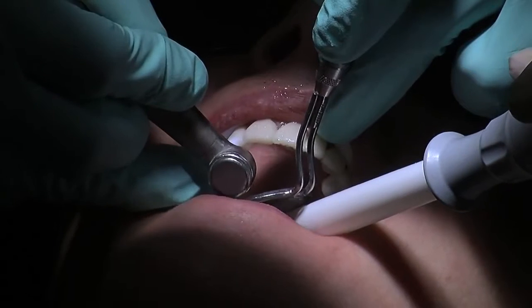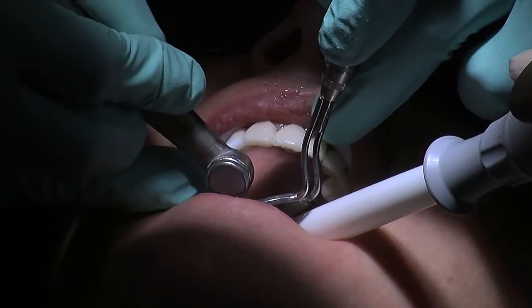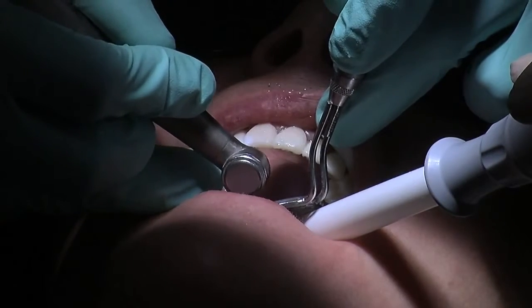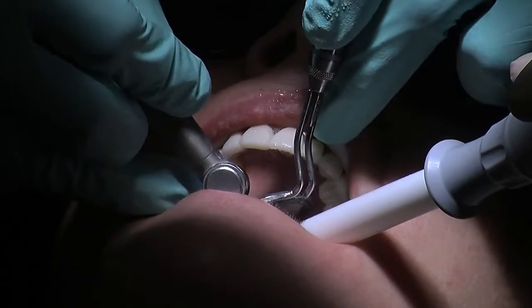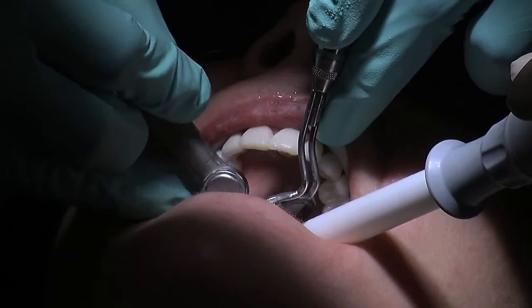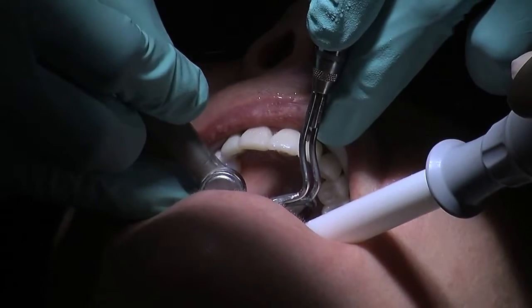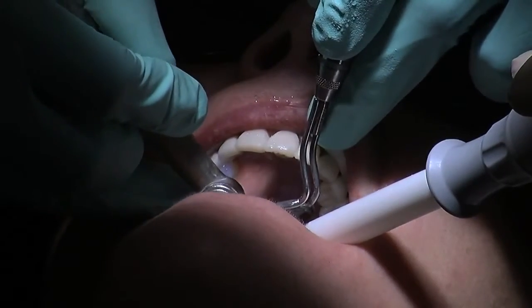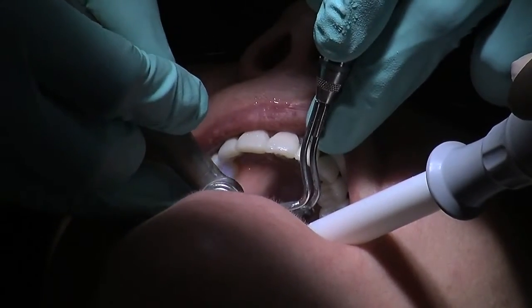So what I'm doing now is just going around the cervical margins of the crowns and just removing any very thin flash, very gently. So I do all that labially and palatally. That's my first objective when I sort the temporaries out, before I do any aesthetic changes.